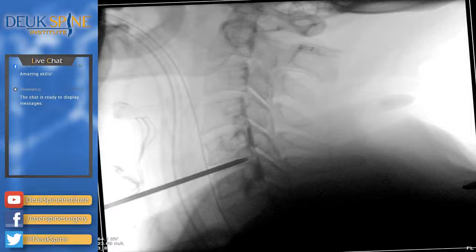Now I'm going to bring this little tube down. You all see this little metal tube? That's going down the dilator, and it's going to slide down into the body. And again, gently I'm twisting it, rotating it, just so it doesn't grab onto anything that is passing by and cause damage. So sometimes you can tear a little vein, no big deal, but honestly, why have anything? Try to be perfect. So everything I do, I've perfected.